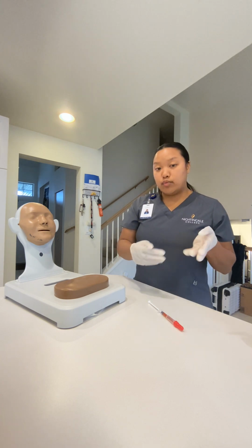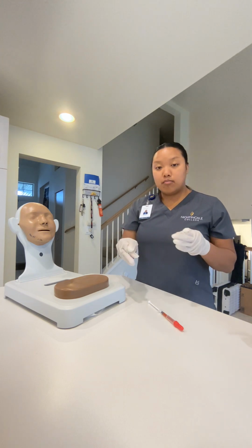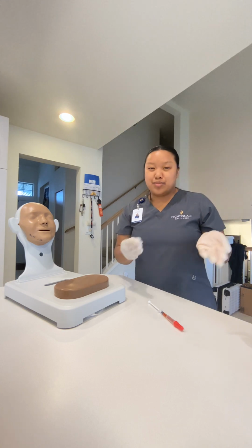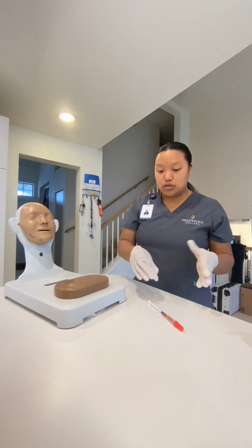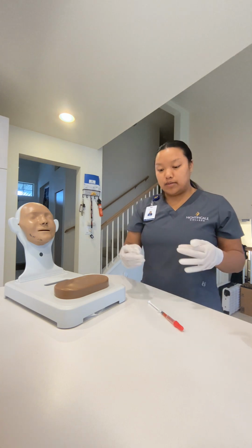pull this medication away from the patient's bedside, then we want to label it with their name and/or the drug and the dosage. Okay, so for me, I wouldn't put their full name. I'd probably just put like their initials and then the drug and then the dose that we're giving them.